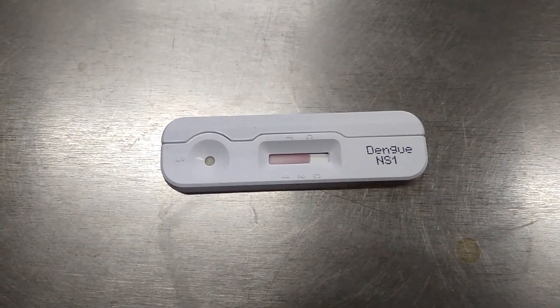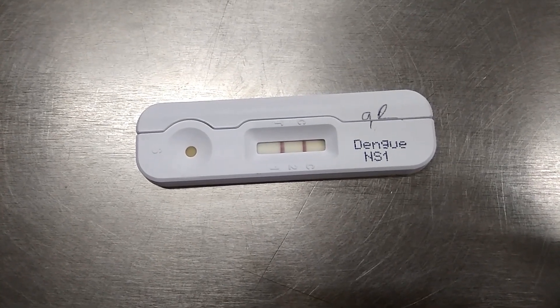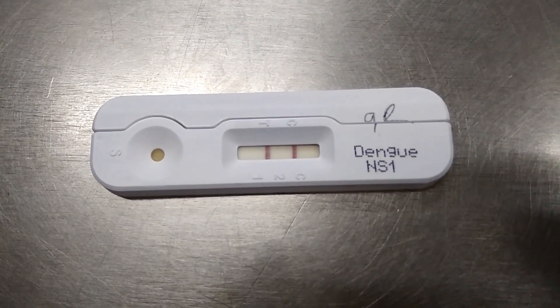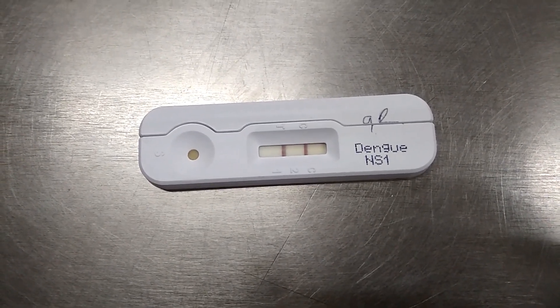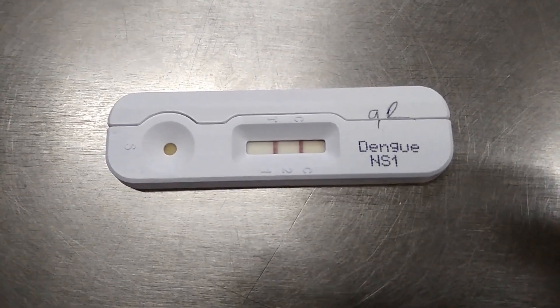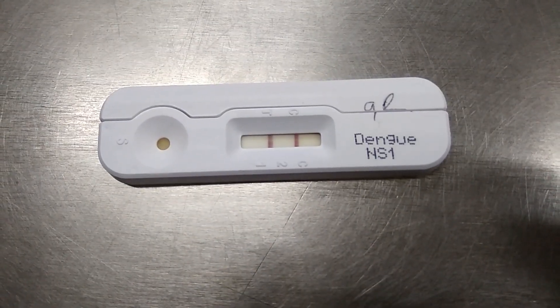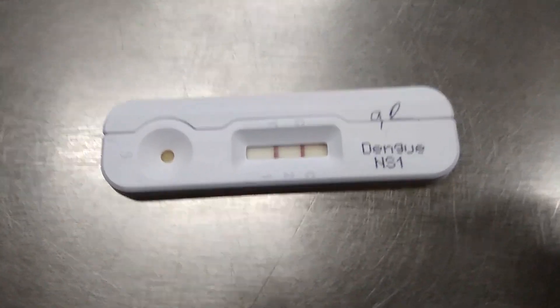Here you can see the test is positive. In this way, you are able to report the test within half an hour: 10 minutes for clotting, 5 minutes for centrifugation, and 15 minutes for test device result interpretation. Here you can see the test is positive — that is, NS1 antigen is present in the blood.